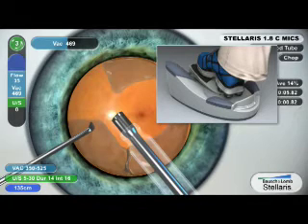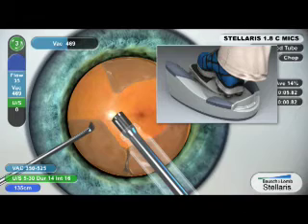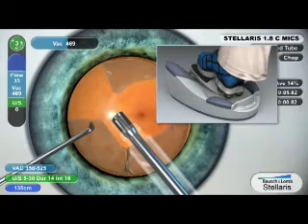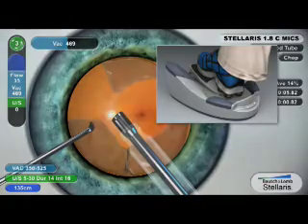Vacuum, flow, bimanual, coaxial, micro-incision, chop — the Stellaris brings together innovations in fluidics, power modulation, and intuitive surgeon control to support your approach to cataract surgery.